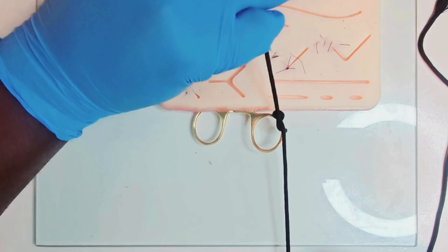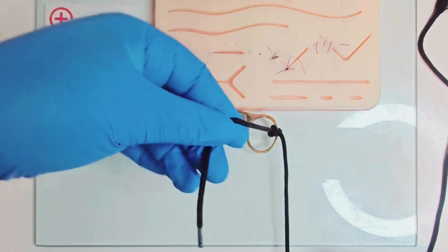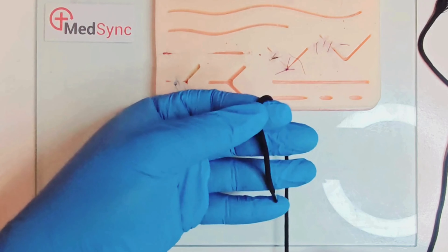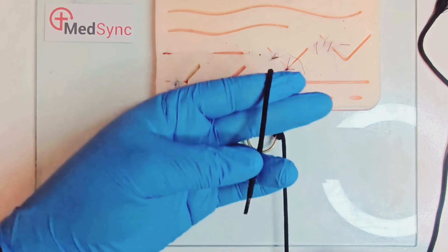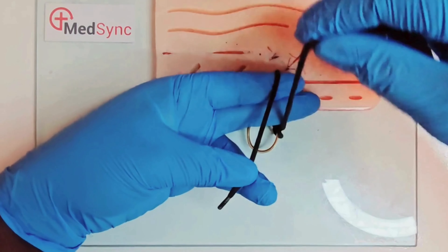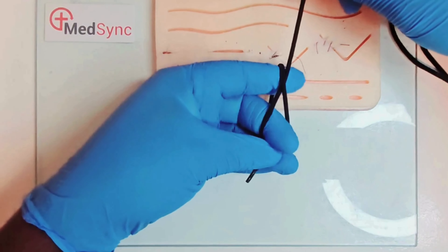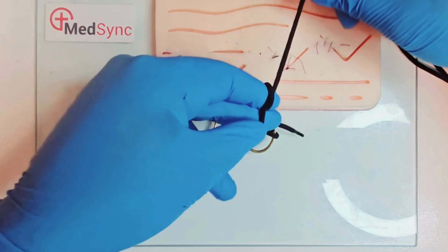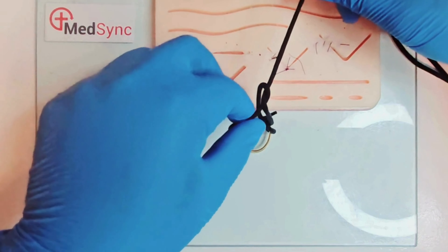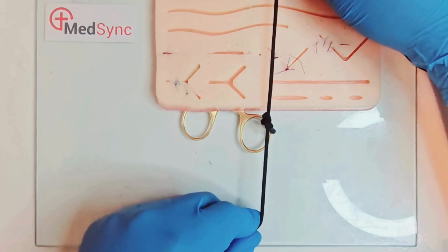Grasp the short end between index and thumb and supinate your hand toward you. Slide your fingers down the thread to grasp it between thumb and ring finger. Run the long suture up the index and middle fingers parallel to the short thread. Flex the middle finger over the long thread and push the short suture under it. Squeezing the short thread between index and middle, pull the short thread toward yourself. Tighten this knot, and now repeat.